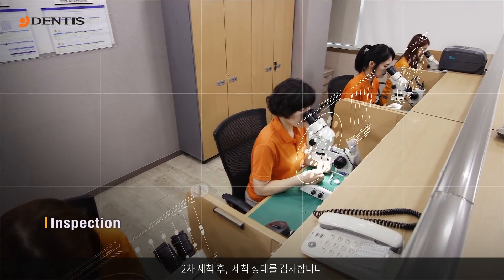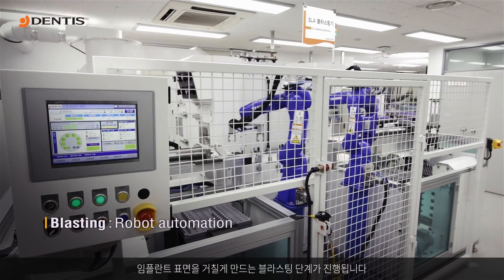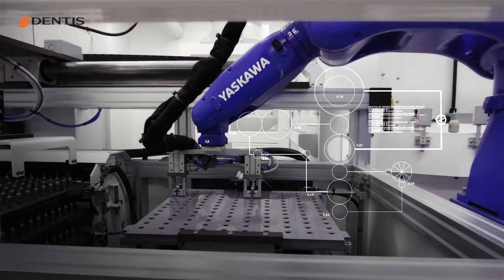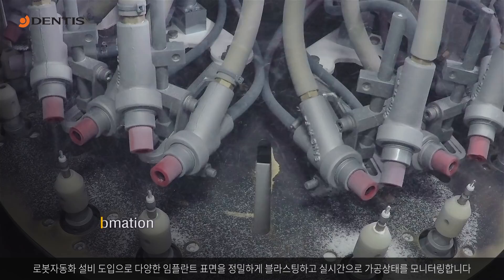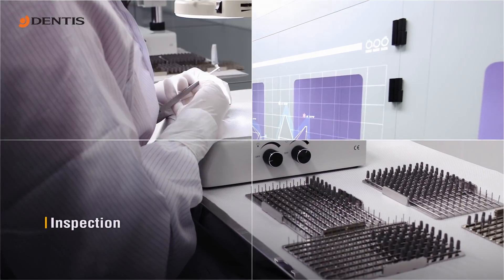The implants are inspected after the second cleaning. Blasting makes the fixture surface rough. Automated robots ensure precision in blasting of the implant surfaces and monitor and inspect the surfaces in real time.